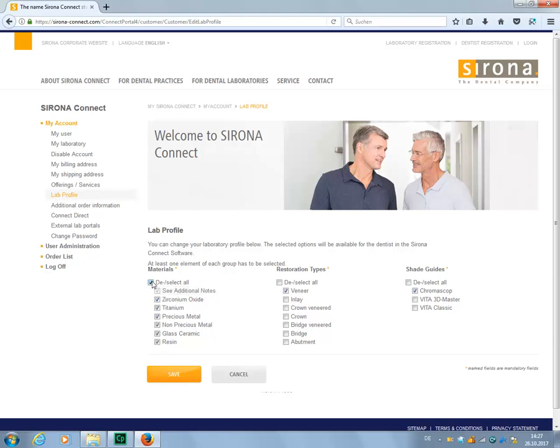Let's switch to the restoration types and select All. Clicking again deselects all the restoration types. Since no selection has been made, but at least one element must be selected, a message appears in red here.